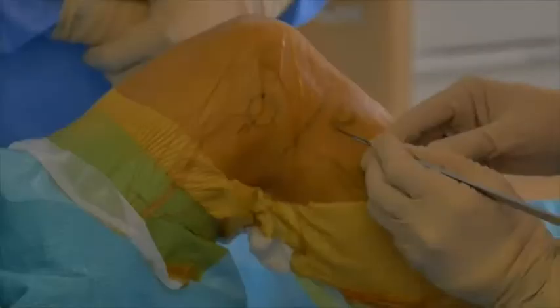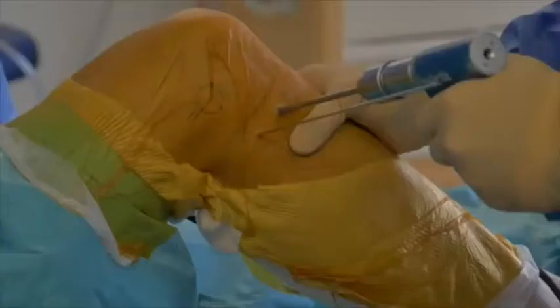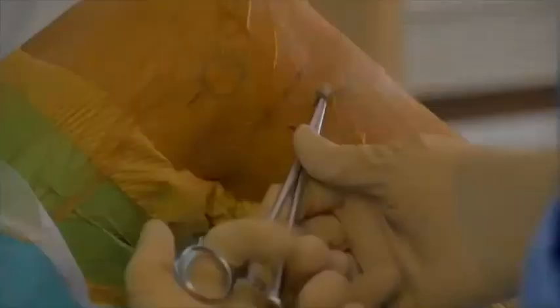Two stab incisions are made 1cm distal to the joint line between the Gerdy tubercle and the fibular head. K-wires are placed and a 4.5mm drill is used to create a bony tunnel on the tibia. The two tunnels are connected in a subcortical fashion and an ethibond wire is passed.